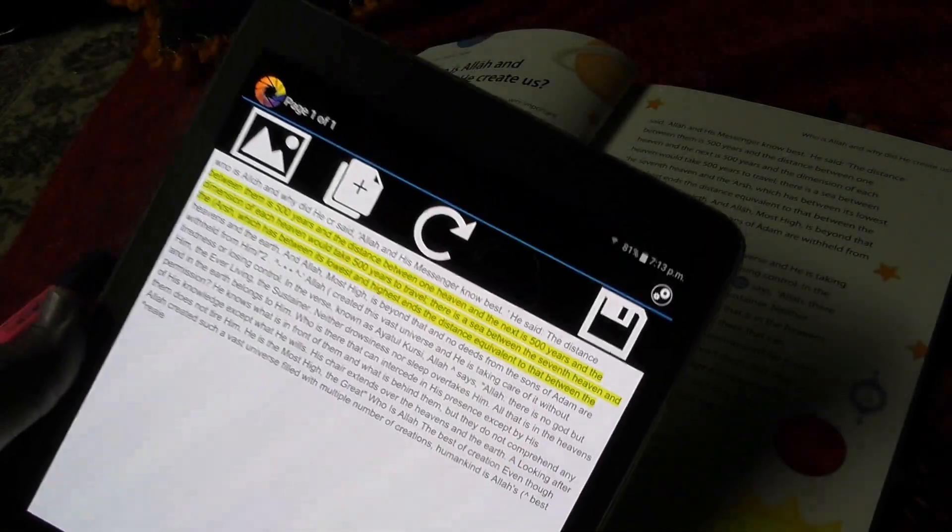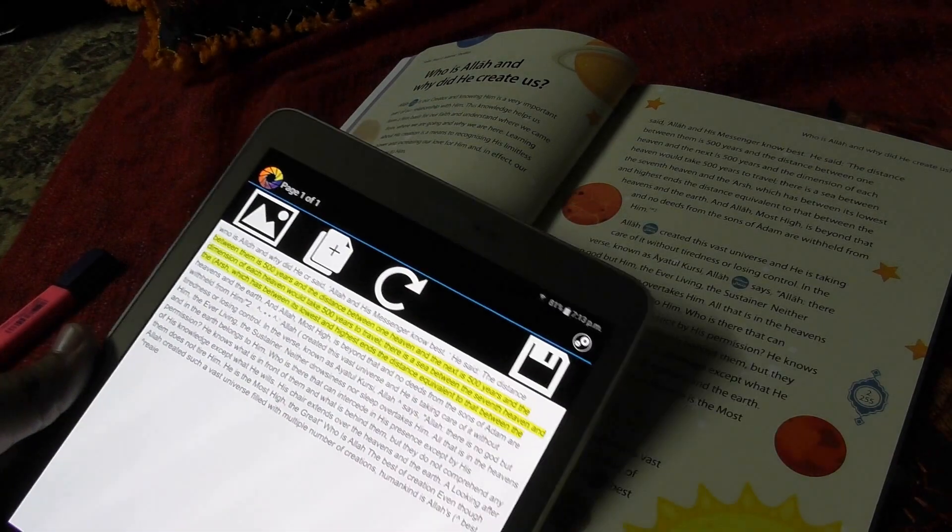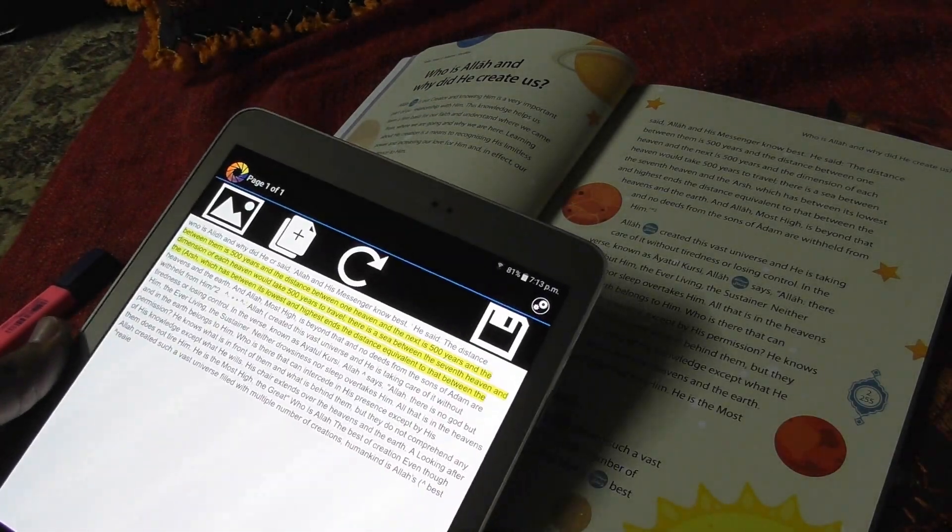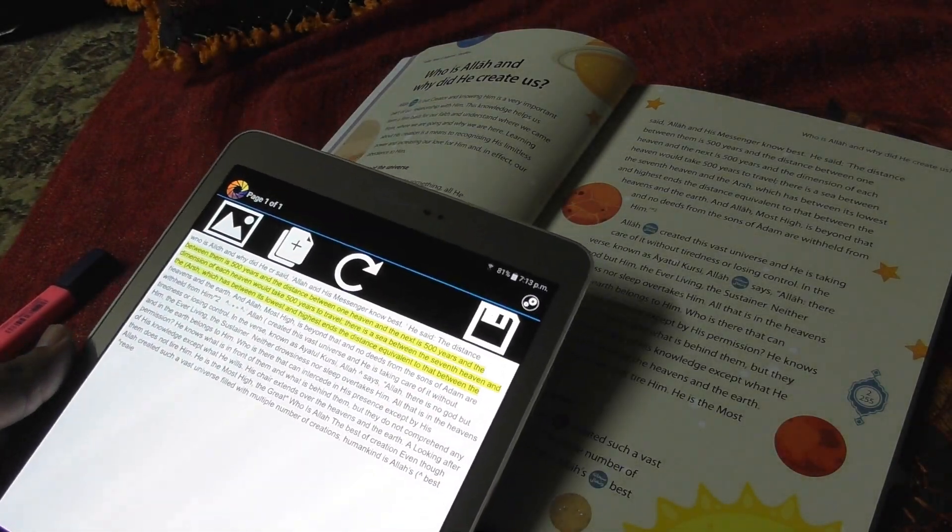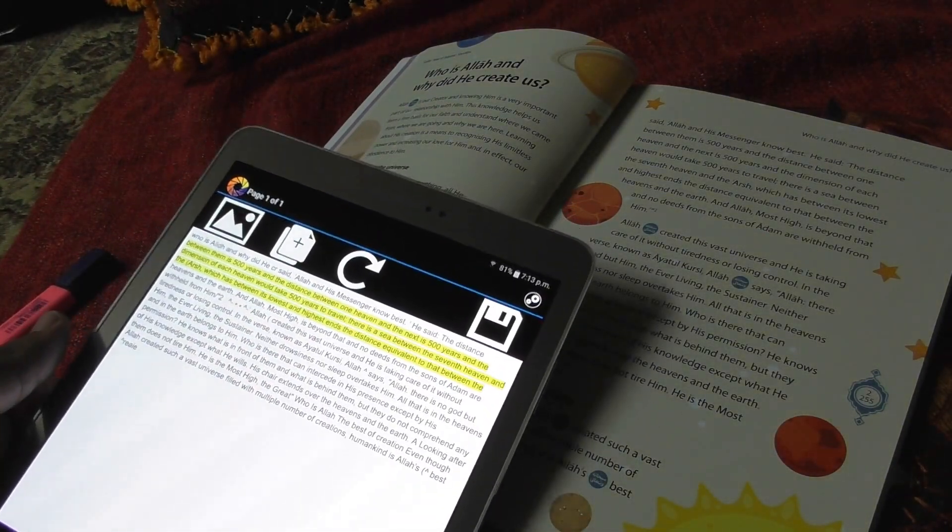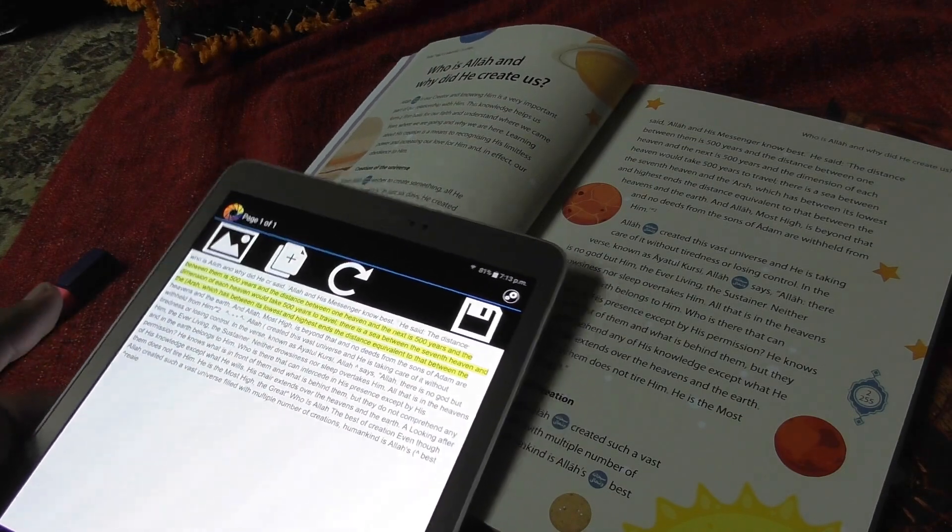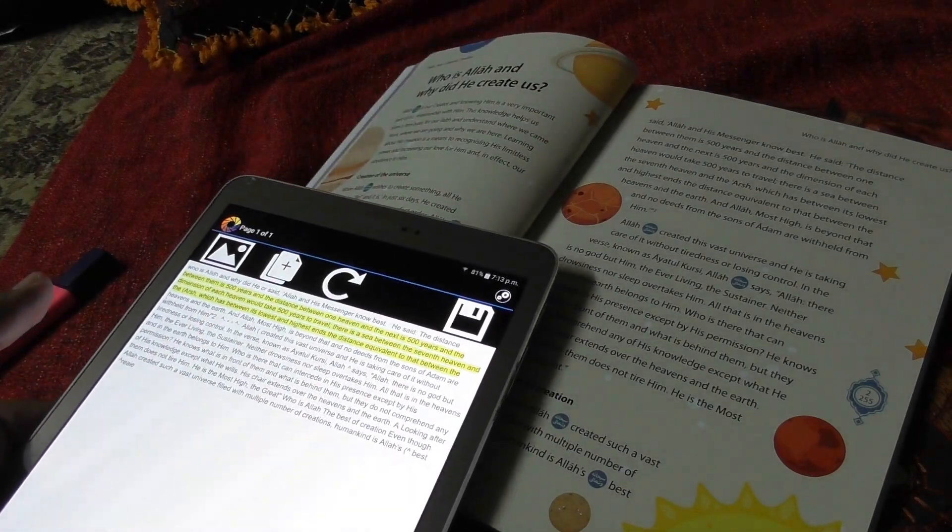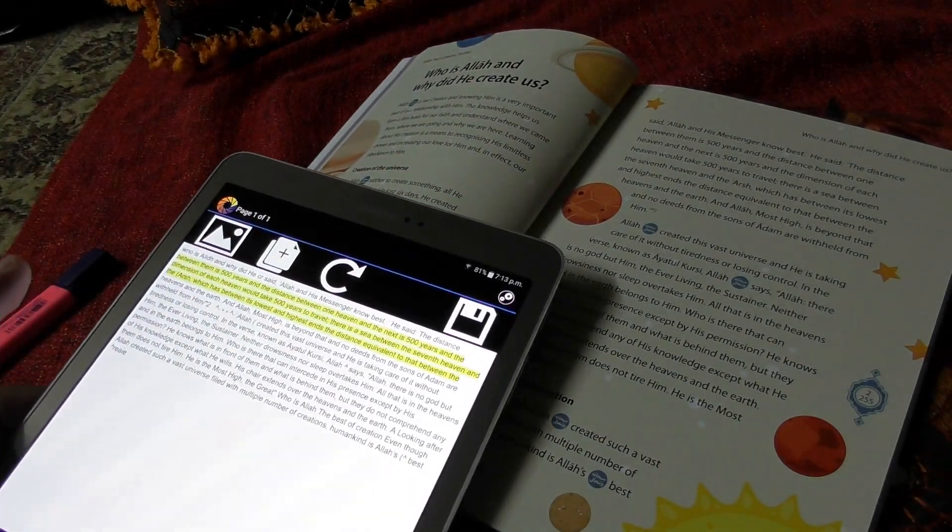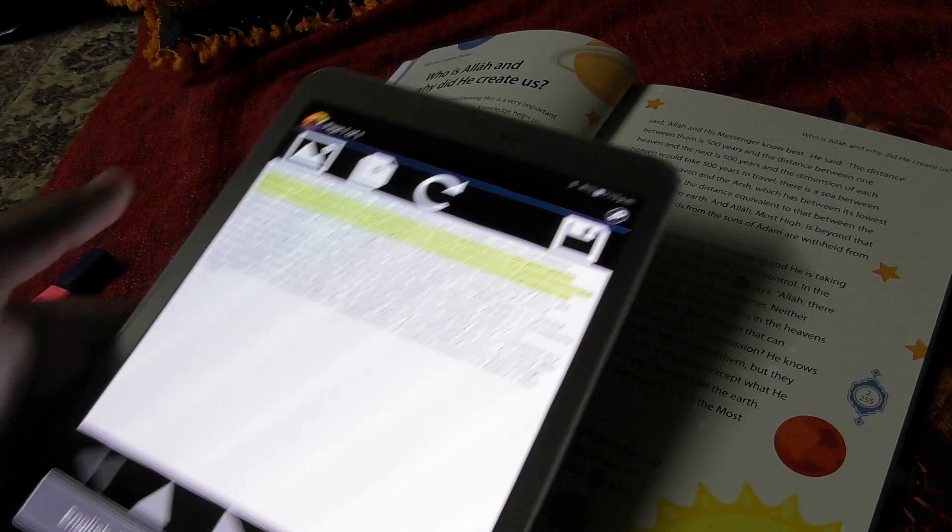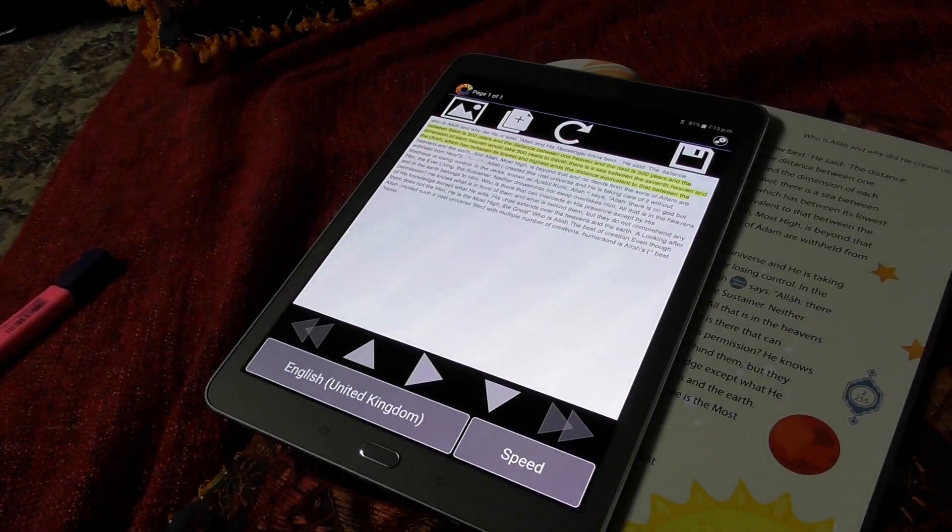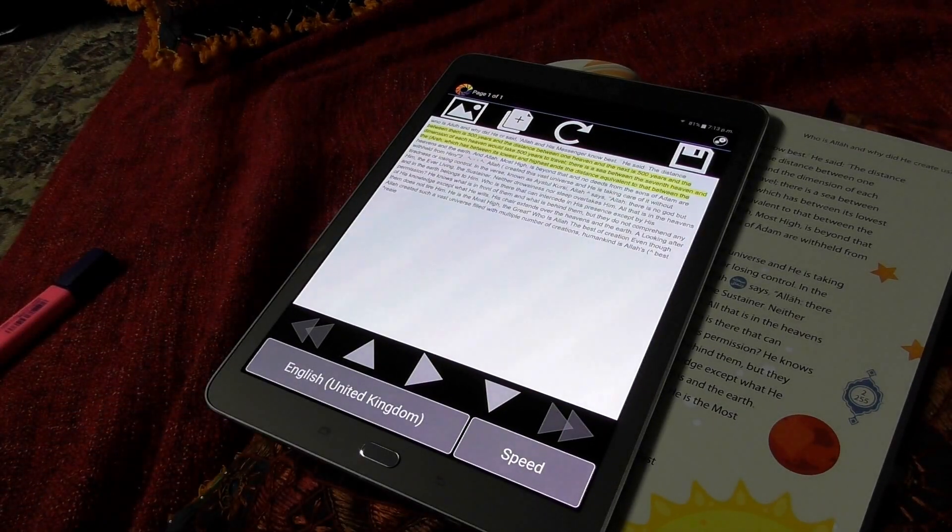So this is how we use this particular app. It's best used when you have a worksheet with lots of text, or you have a textbook with lots of writing in it.